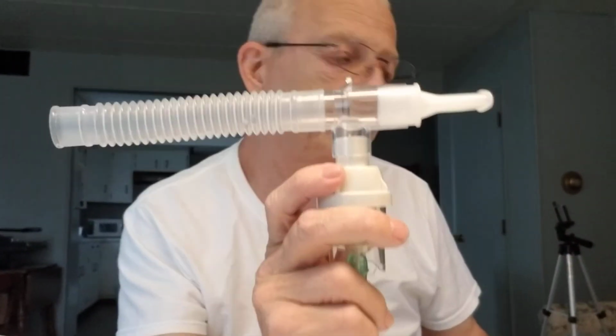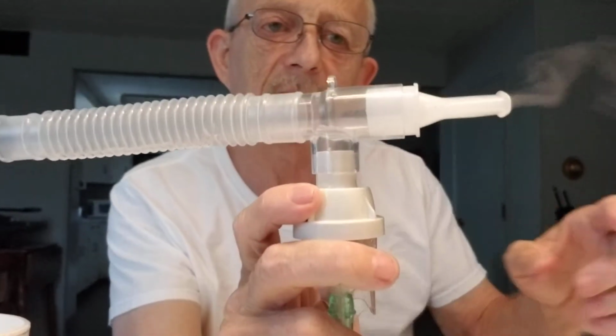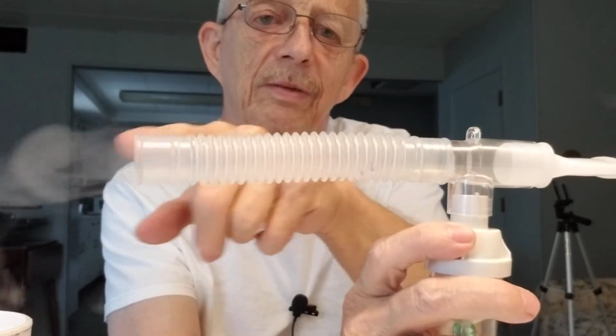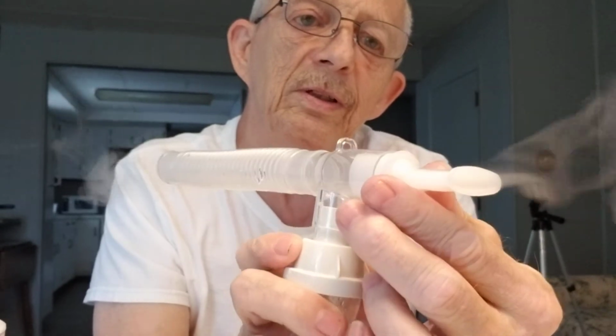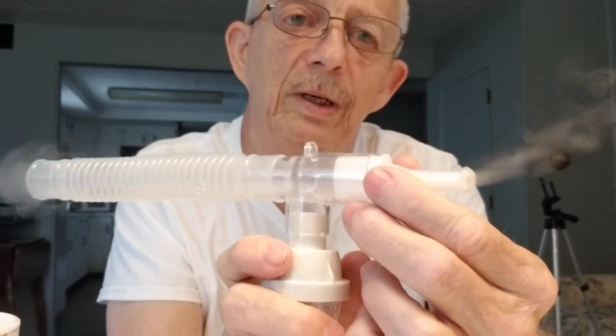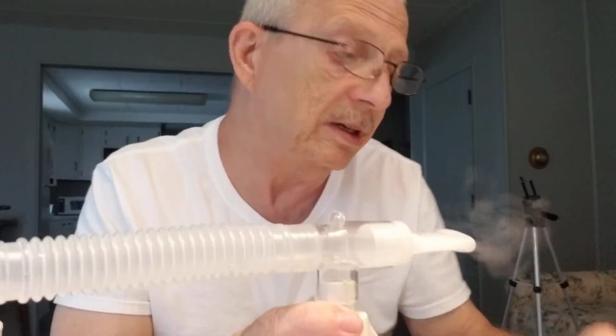What you want to do is just turn on the machine, and instantly you'll see the vapor is coming from here, the vapor is coming from here. You want to place your lips around this mouthpiece, keep your tongue out of your way, and inhale deeply. As you could see when I was inhaling, there was no vapor in here. All that was going into my lungs. You simply repeat this process until it's done.